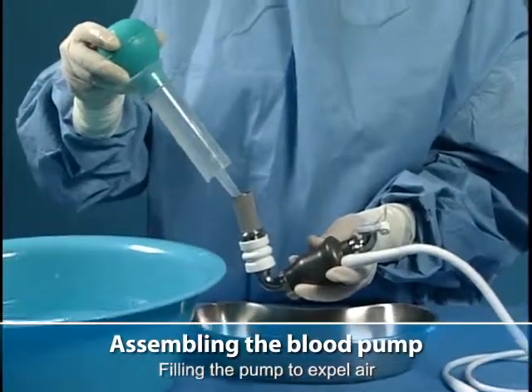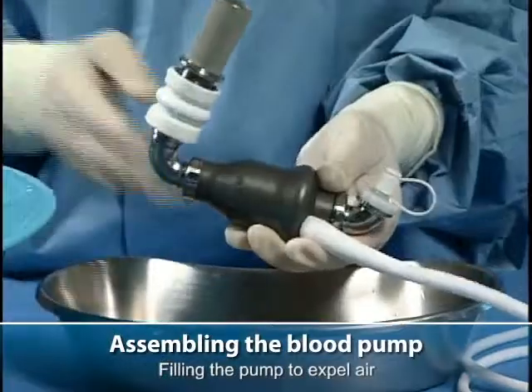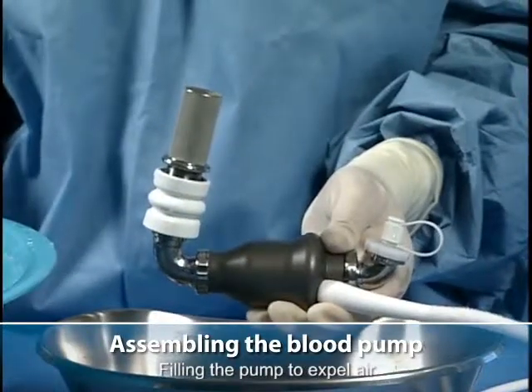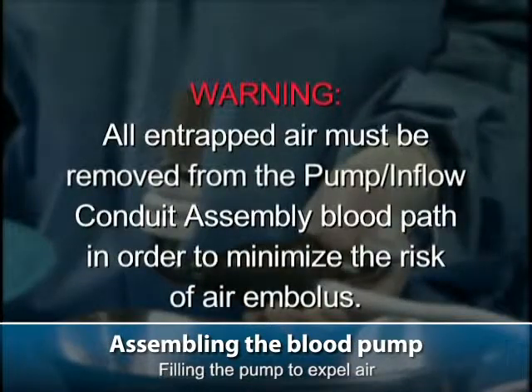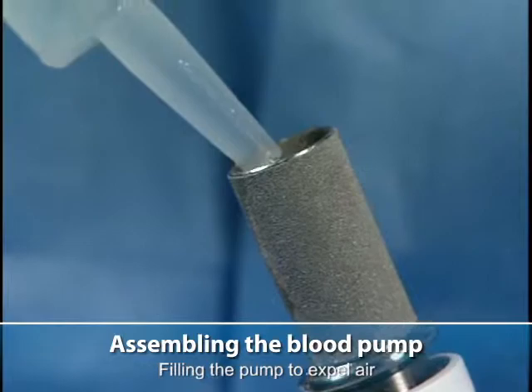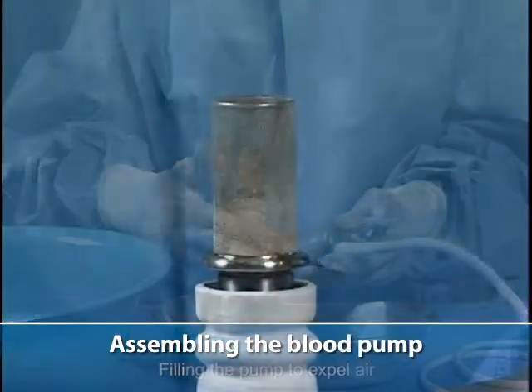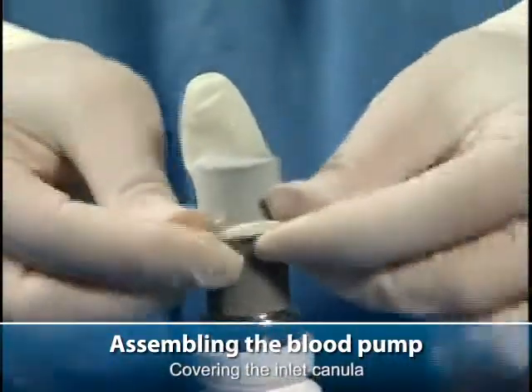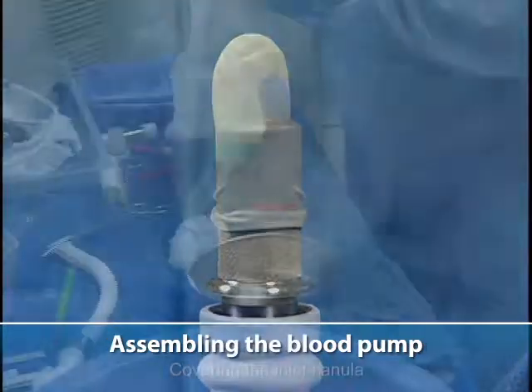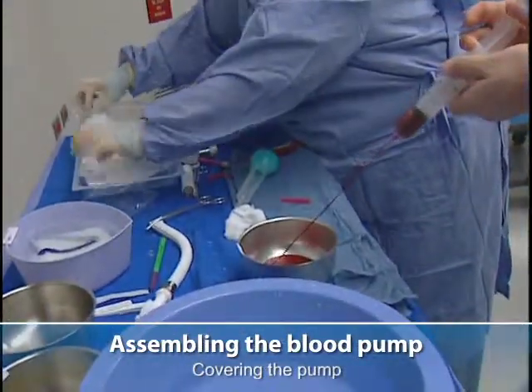Filling the pump to expel air. Covering the inlet cannula. And finally, covering the pump with antibiotic soaked lap sponges and a sterile towel.